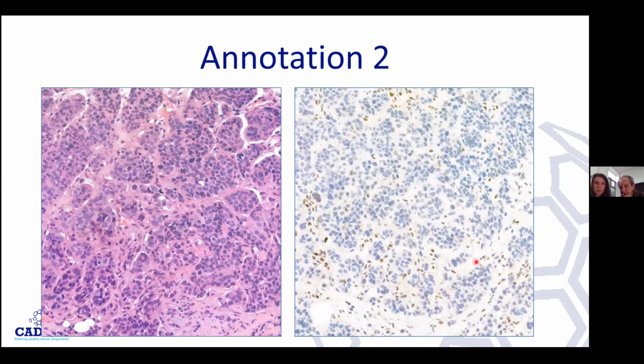So now this poses the question. This looked like a high-grade serous carcinoma, by the way. It had lots of mitosis, and it's possible that it has a clone. We know that low-grade versus high-grade, there may be heterogeneity. There are tumors with heterogeneity.